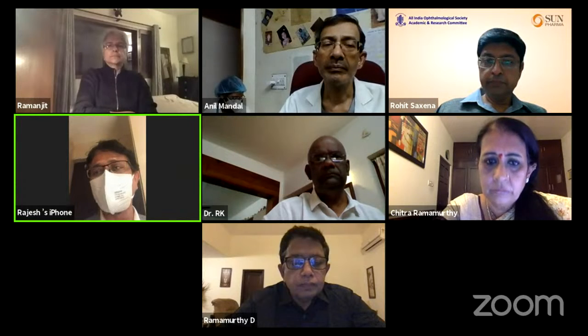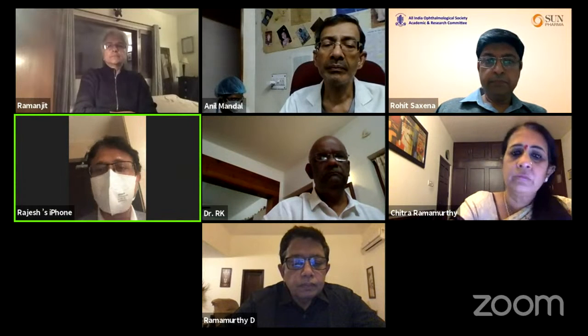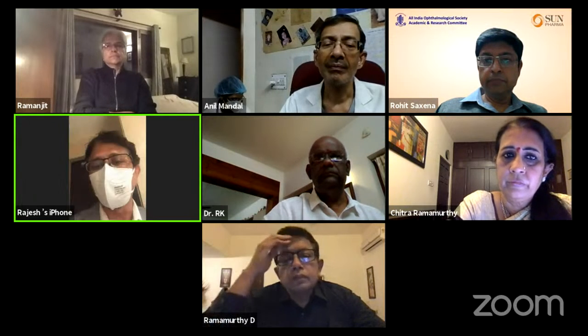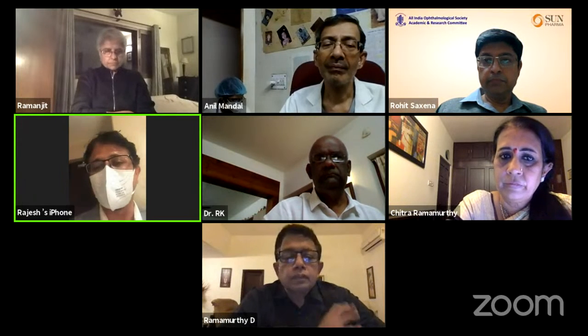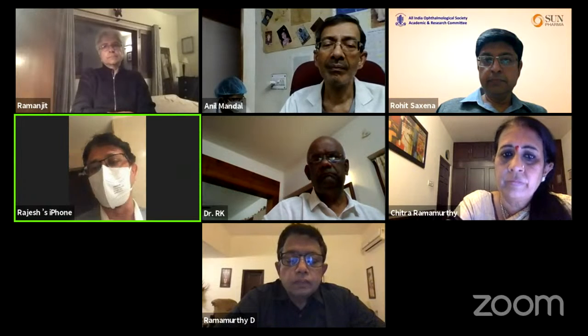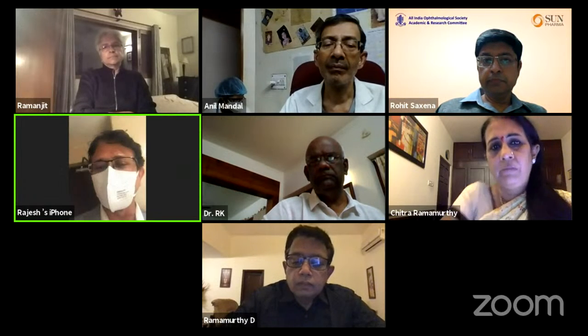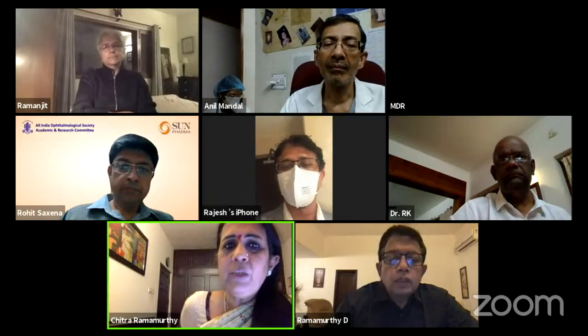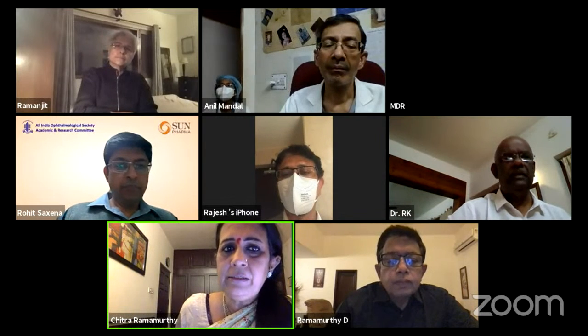So iOCT, we call it a third eye, gives you an idea at what position, at what layer, at what level you are working. So it's a good tool. It's really a good tool for lamellar keratoplasty. Any other questions from the expert panel?